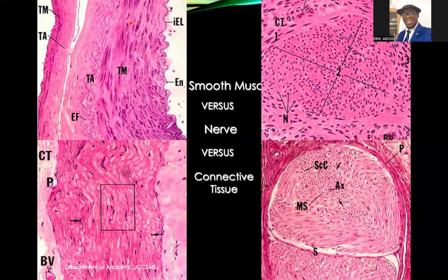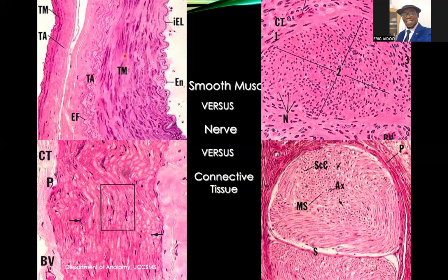This is showing you a blood vessel. That is the internal elastic lamina, that is the endothelium, and that is the tunica media and tunica adventitia. You usually have smooth muscles in the tunica media of the blood vessels. The nuclei are fusiform.